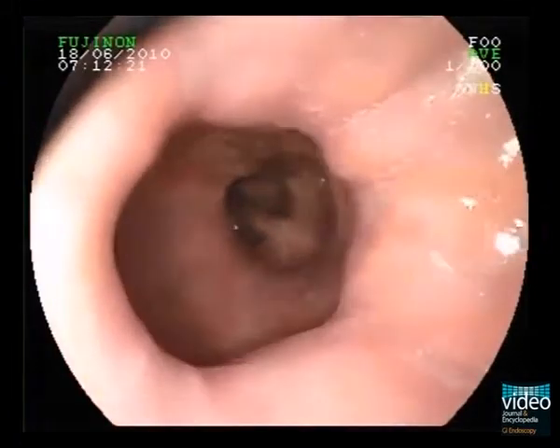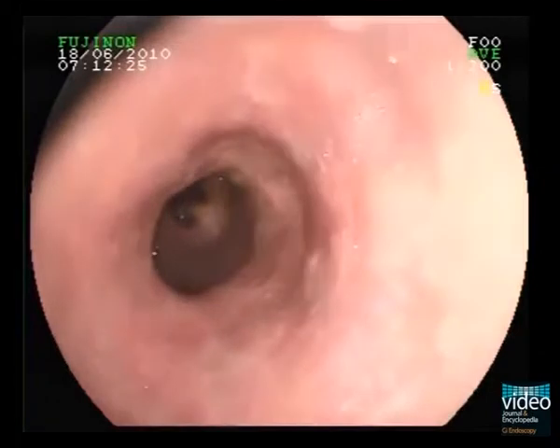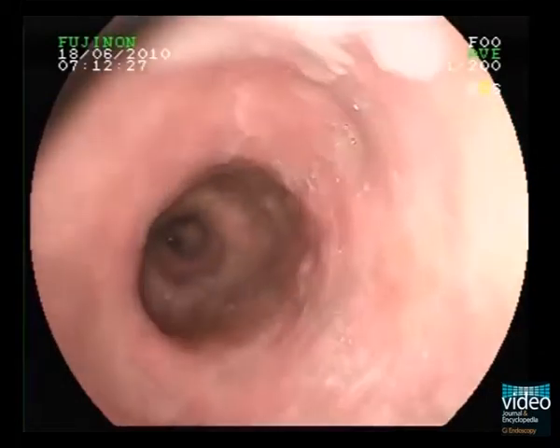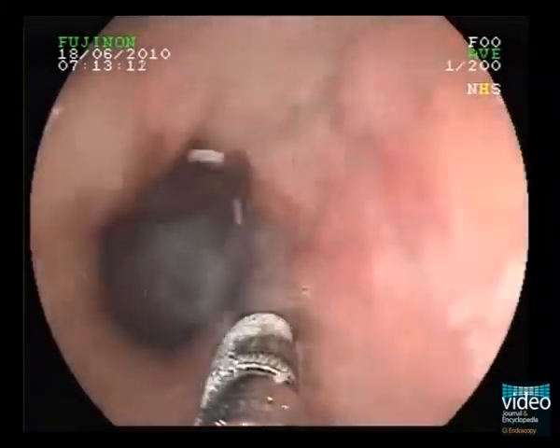This is a 66-year-old Caucasian male patient referred for endoscopic diagnosis and treatment of early Barrett's cancer. During pullback, a mucosal irregularity can be visualized at the 3 o'clock position.